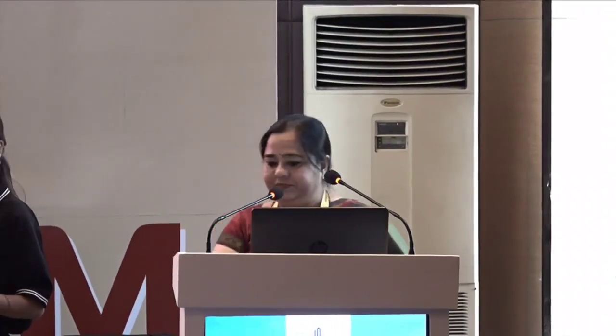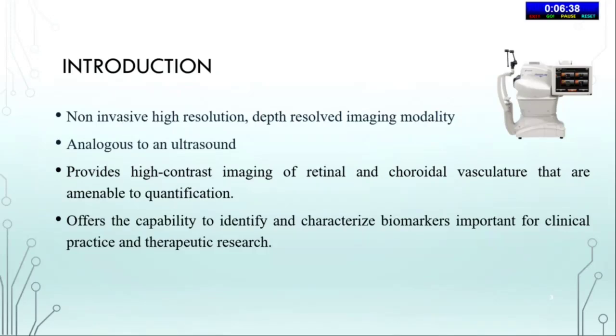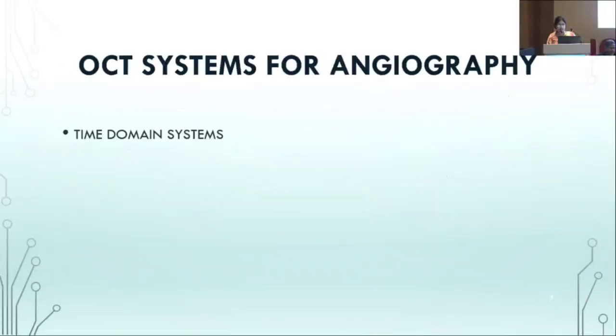Dr. Anushri. Good afternoon, everyone. I would be discussing in brief about OCT angiography, its artifacts, retinal biomarkers that are already described in OCT angiography, the novel methods of analysis and biomarker-free diagnostics. It is a non-invasive, high-resolution, depth-resolved imaging modality analogous to ultrasound. It provides high-contrast imaging of retinal and choroidal vasculature that are amenable to quantification. It offers the capability to identify and characterize biomarkers important for clinical practice and therapeutic research.